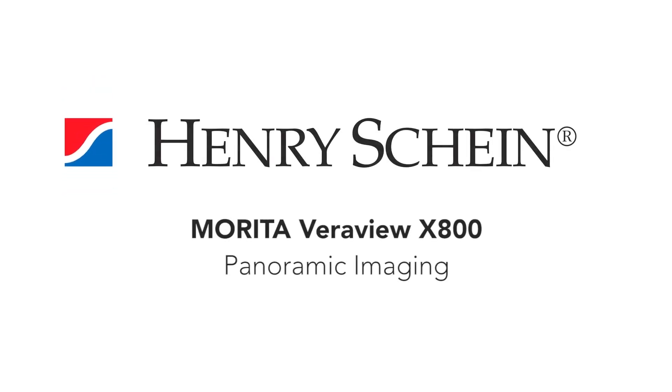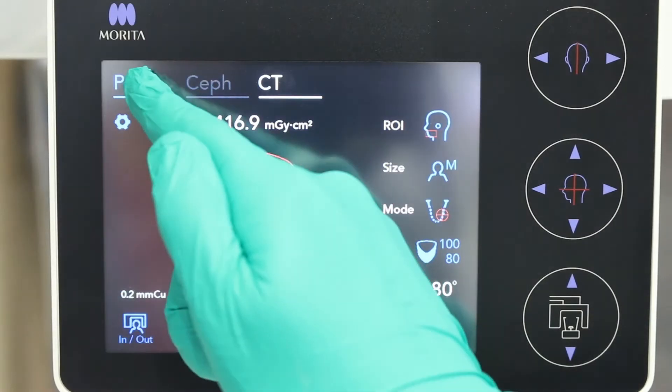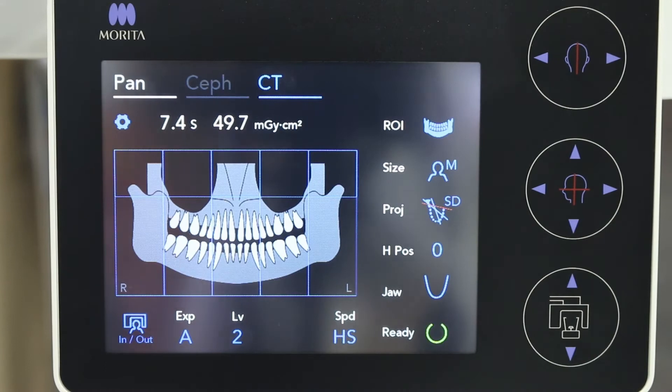Acquiring a high resolution panoramic image with the Veriview X800 is a simple procedure. First, select the pan on the touchscreen control panel.